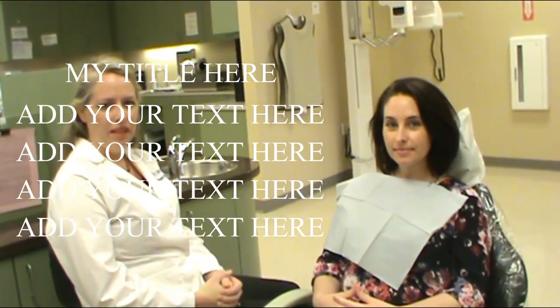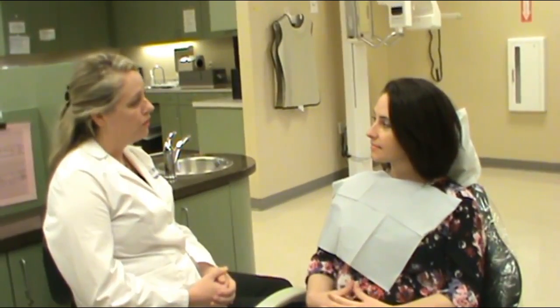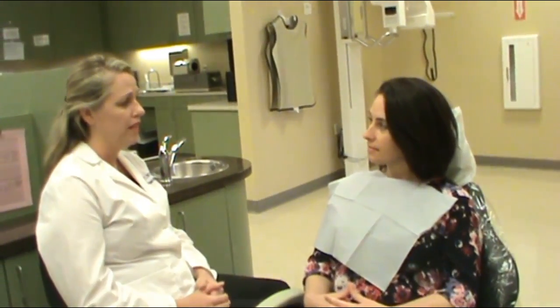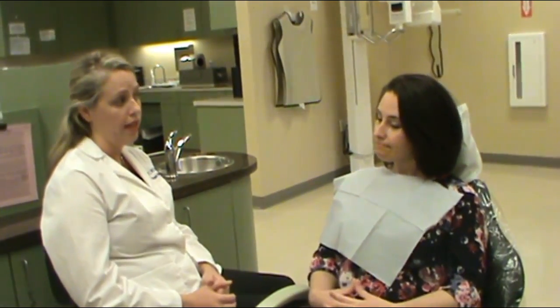This is our intraoral assessment and the first thing we're going to do is explain the procedures to the patient. Ms. Cruz has volunteered to be our patient today. Ms. Cruz, we're going to do an intraoral cancer screening. Was there anything your last dentist was keeping a watch on, or anything you're concerned with in the mouth that you need me to look at?